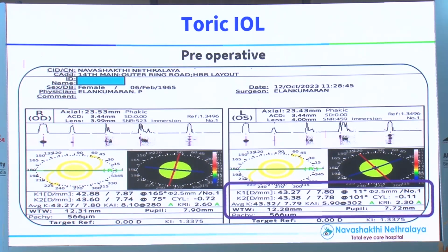these advanced monofocal lenses. Now, what is the most important thing that you have to consider whenever you think about giving good vision to the patient? The first thing you look at is the toricity. We have been traditionally taught that with a toricity of more than 1, we do not use advanced lenses. But when it comes to multifocals, EDOF is slightly forgiving, but for advanced monofocals or multifocals, trifocals, please consider this value as 0.5.